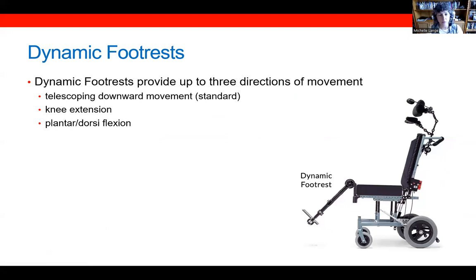So dynamic footrests provide up to 3 different directions of movement. First, there's a telescoping or downward movement, and that's a standard feature on the seating dynamics dynamic footrest. There's also knee extension, as well as a plantar and dorsiflexion movement.